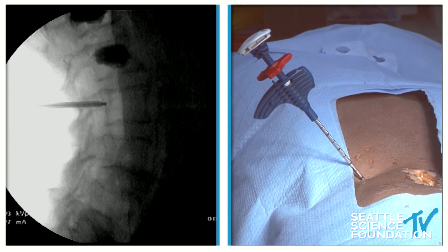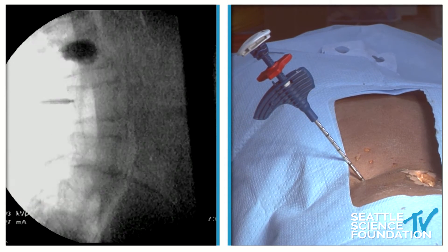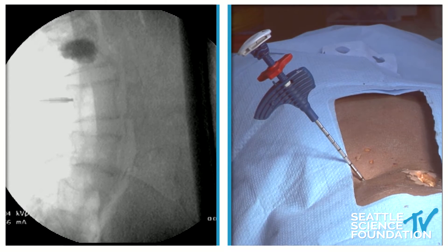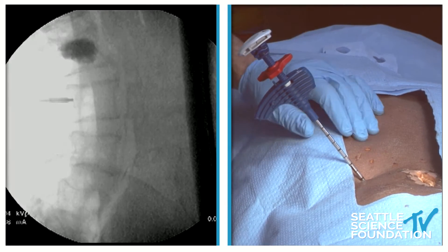Drop it down a bit so we can see the vertebral bodies better. We can see the stylet that's inside the cannula, and that has a throw — a predetermined curve. You can kind of see where that's angling.